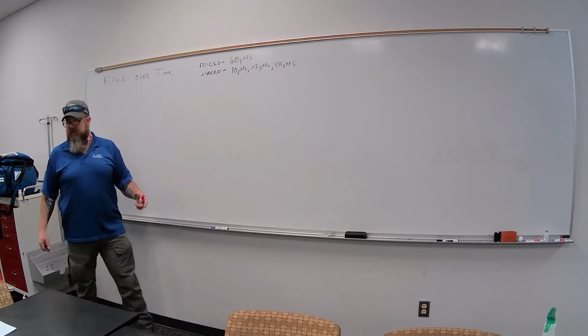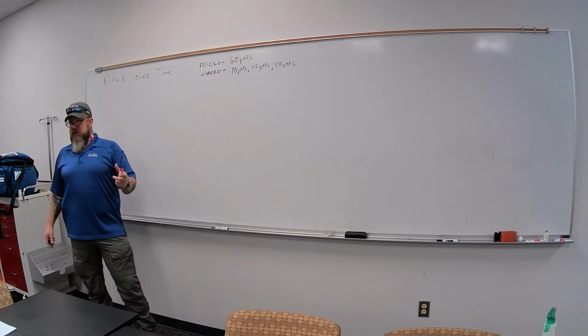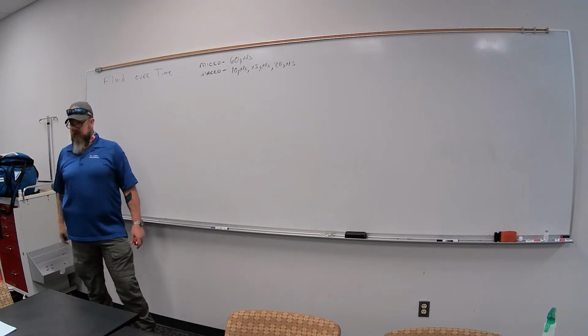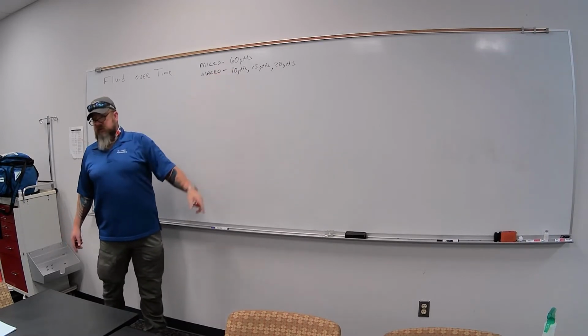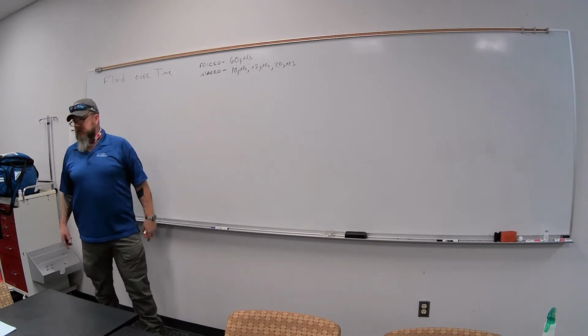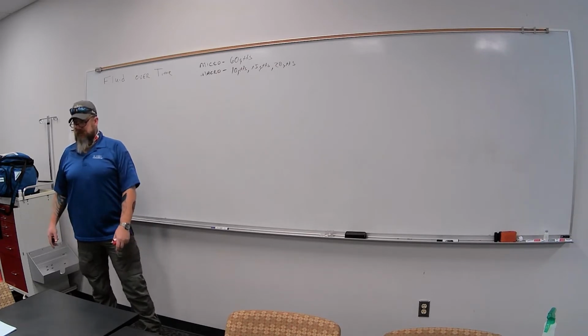You can get them individually, or they have these sets that you can dial in, and it has 10, 15, and 60 on it. So one set could actually be both of these. But they don't use them much anymore because they're a little more expensive than a regular drop set.